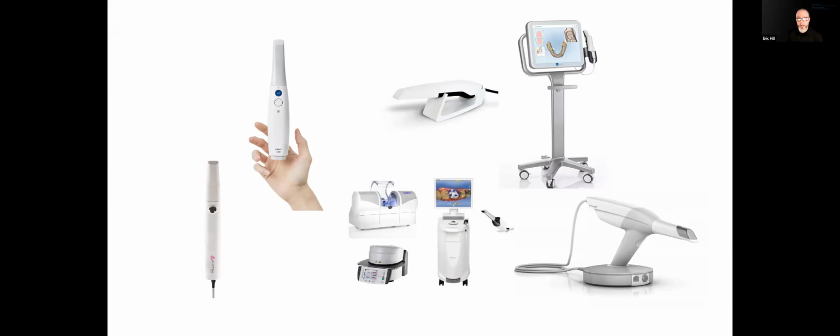So if you're getting something like a Medit and you weren't trained properly, or you get a Sirona and you get overwhelmed by the software and it's simply not intuitive, and you're scanning and you're going over things a million times to try and fill in data, that can get overwhelming, and because of that, you're not going to get good scans. I've seen folks, because the time is on the screen when I'm logging into some doctor's offices, where somebody might be scanning in the mouth for 5 minutes or 6 minutes, when you really should be somewhere sub 1 minute. So training is the difference maker there.